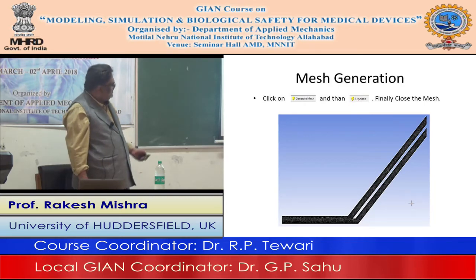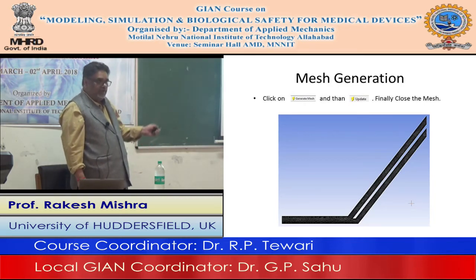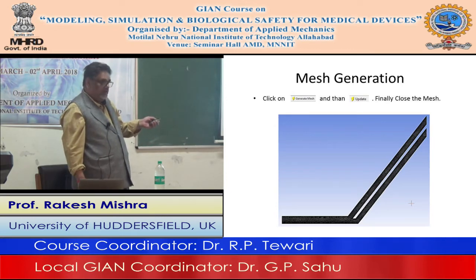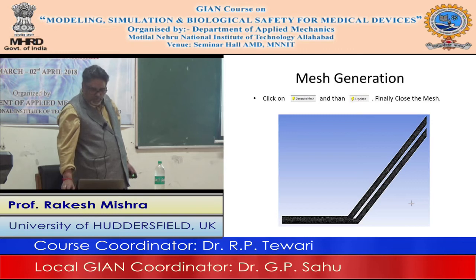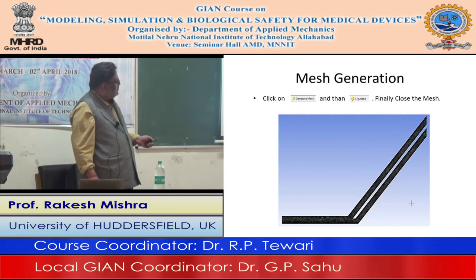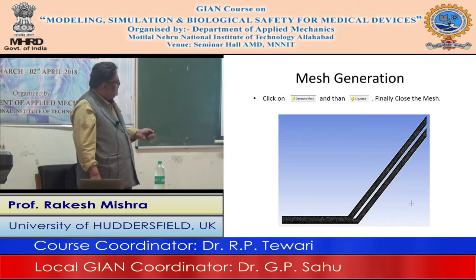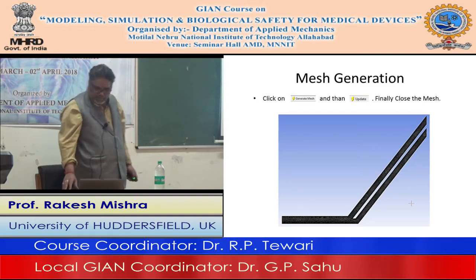Now this part also you have done, so I would like you to again, if you have any doubts, ask me. I'll go through it again. So we now click the setup and open the Fluent. As I mentioned to you, if you are running a very fast computer, you can run having more cores, you can run parallel computing, or if you don't have enough cores, then you can run serial. 3D and double precision. For higher accuracy, you can run higher double precision here.